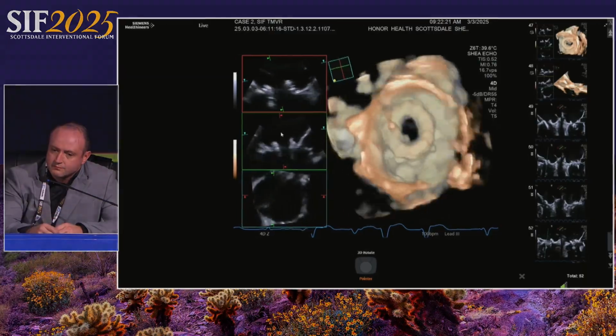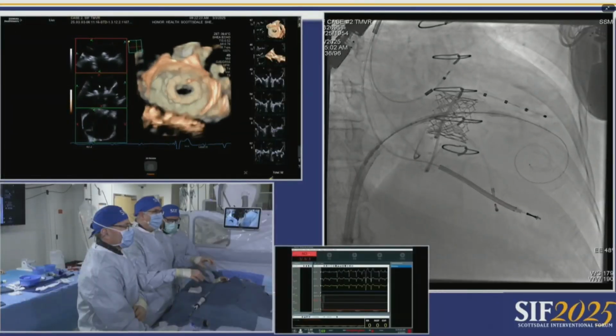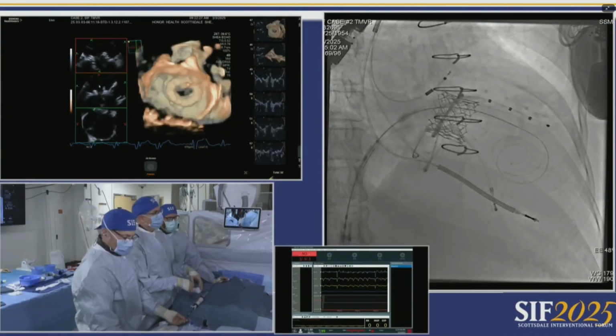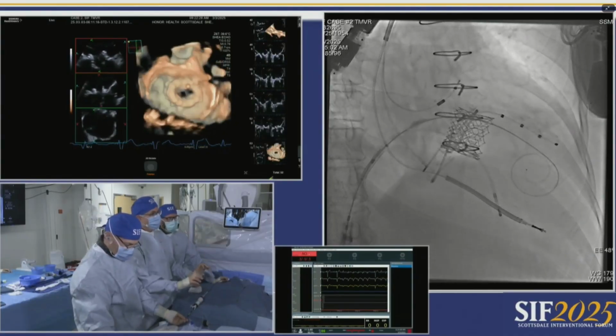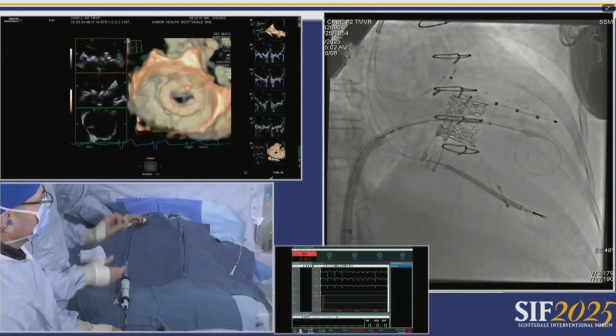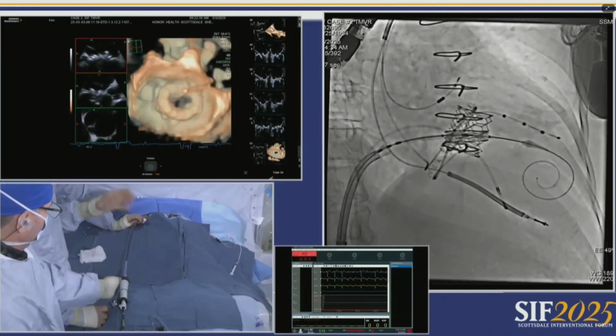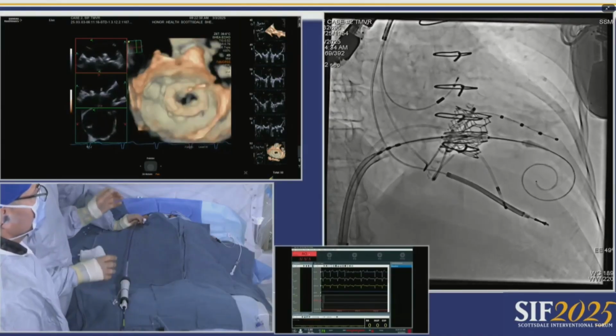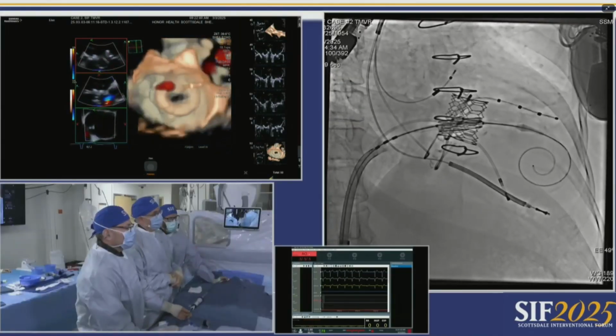So the issue here also is, clockwise, we know we'll bring in more atrial. We played with that a little bit. I tried that to just take it up a little bit. Counterclockwise, we'll bring the valve more ventricular. And then obviously just the push and pull. At the point I was asking him to push forward, that was almost just so it wouldn't come back a little bit. It's hard when it's sort of a little bit inflated like that.